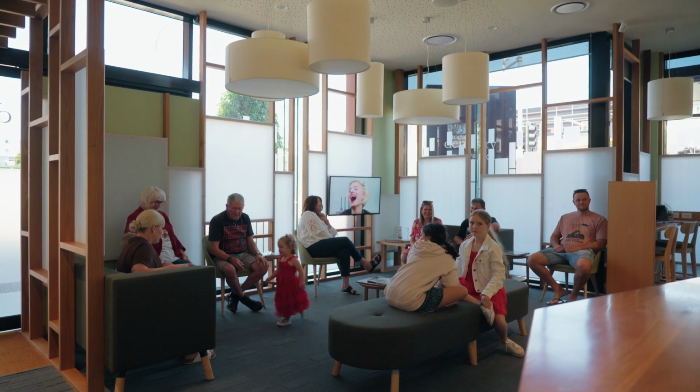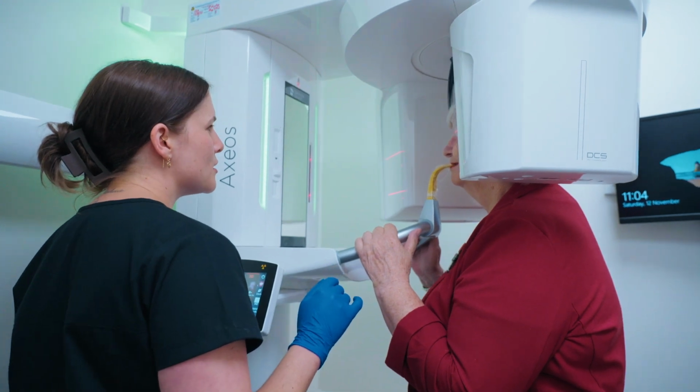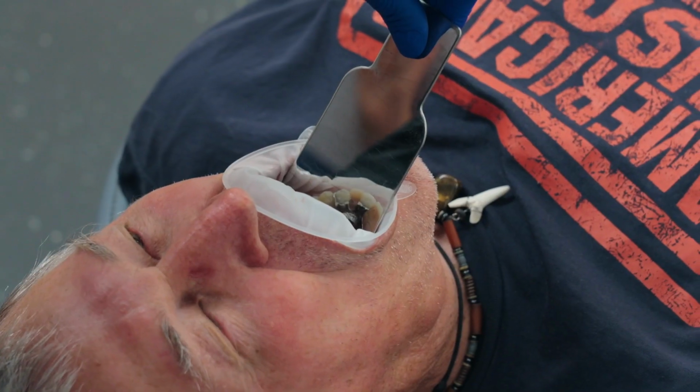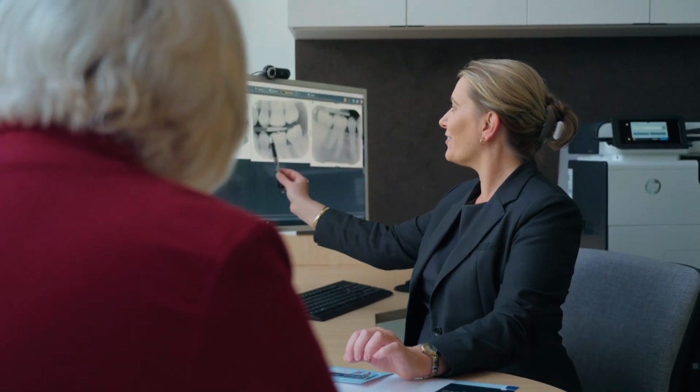I'm one of the dentists and one of the owners of the practice here. We've got a clinical requirement to gather all the information we need about you. We've invested heavily in technology and equipment, so we've got a CT scanning machine or a cone beam imaging machine. We've got our intraoral scanners, intraoral photographs, a good clinical photography kit there, so we can really hone in and make sure that we understand your problems from a diagnosis point of view. We don't have to send you off anywhere else to get other information and then have it sent back.